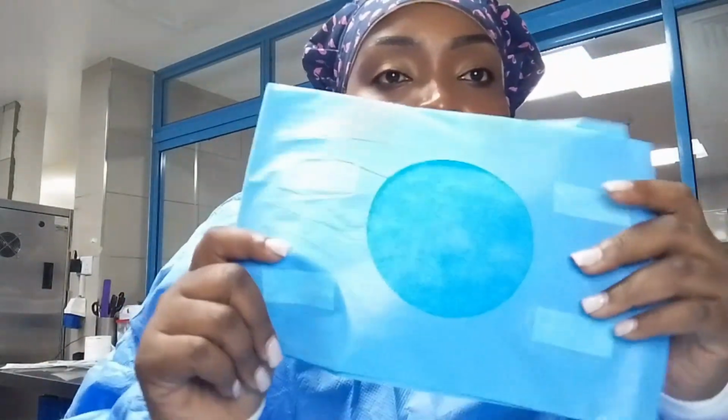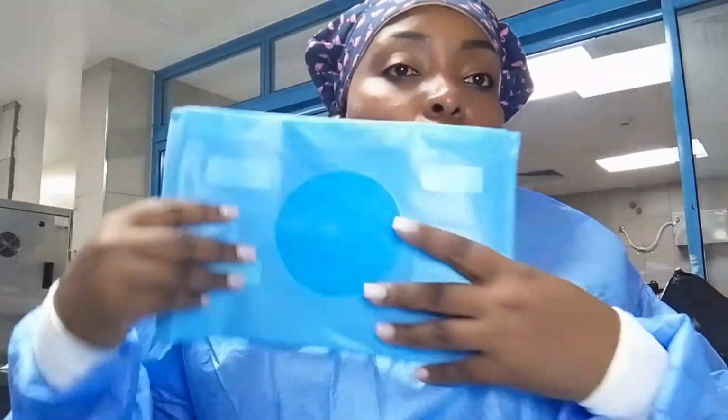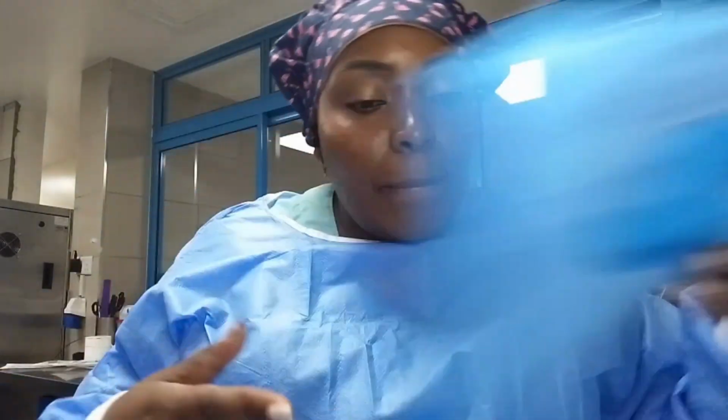You are provided with gloves. This is size 7.5. Then you have the drape. After you have cleaned the site where you are placing, assuming it's the subclavian or the jugular, you will drape that area. This is a drape. You can see even this hole. You will drape that area.